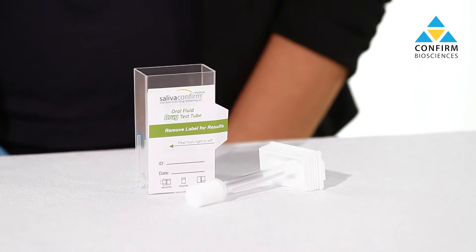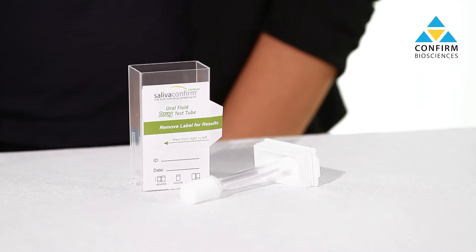Hi, my name is Sophia and in this video I'm going to show you how to use Saliva Confirm Premium. This is the only saliva drug test on the market that tests for up to 11 drugs plus alcohol.